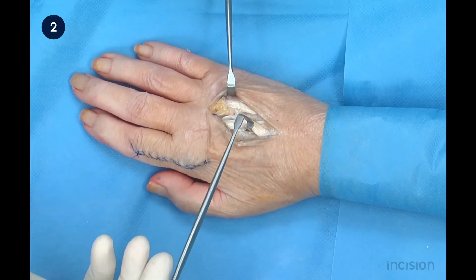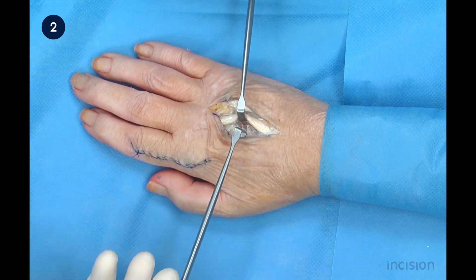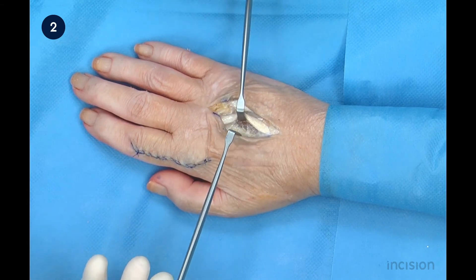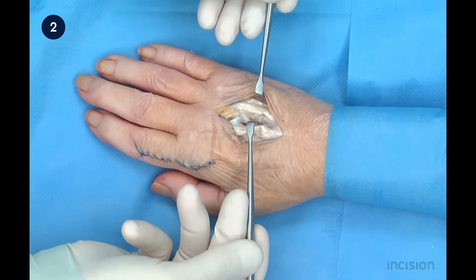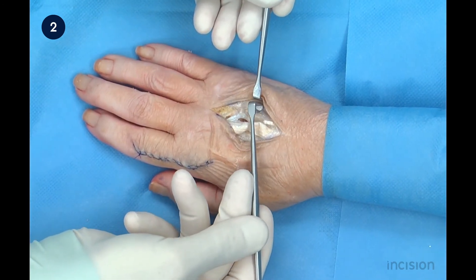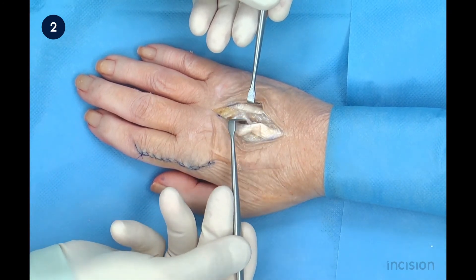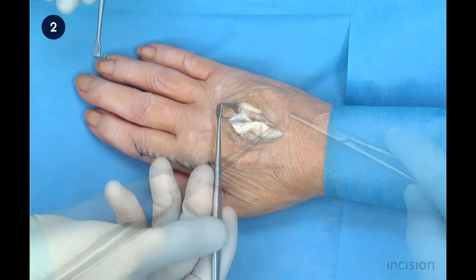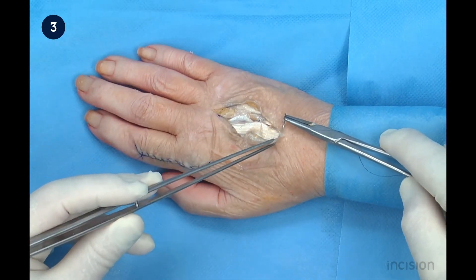The periosteum is positioned over the surface of the bone. It is advised to cover the surface of the bone with periosteum, especially in the case of implant insertion, to minimize its contact with the extensor tendon. The skin is closed with a continuous non-absorbable suture.